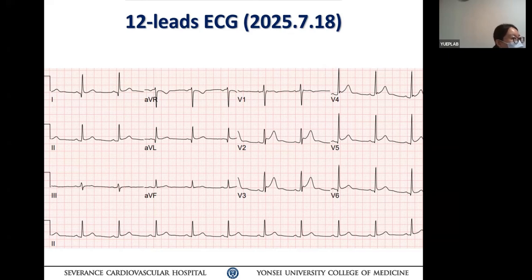Okay. Can we leave the patient without an ICD? That would be the issue. I think if you're assuming that the patient has no structural disease, and you are assuming that the successful endpoints are clear, probably you don't need to, because you have no structural disease. This is a fast idiopathic VT. I don't know how the patient presented at the other hospital. The clinical scenario would also influence your judgment on whether to do it or not.